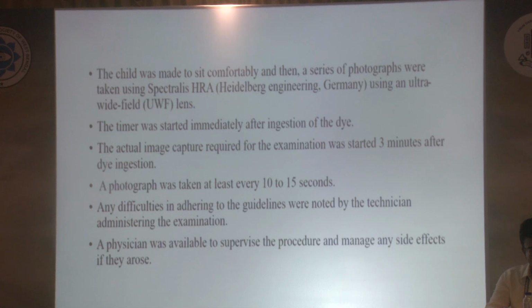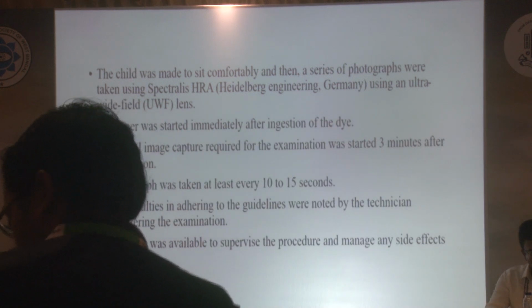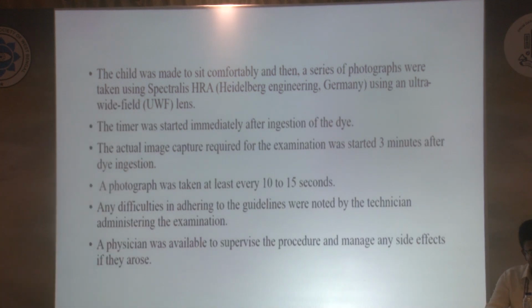The actual image capture was started 3 minutes after dye ingestion, and a photograph was taken at least every 10 to 15 seconds. Any difficulties in adhering to the guidelines were noted, and a physician was available to supervise the procedure and manage any side effects if they arose.